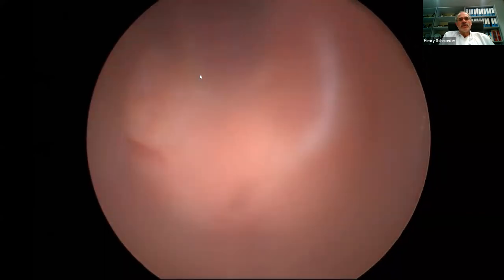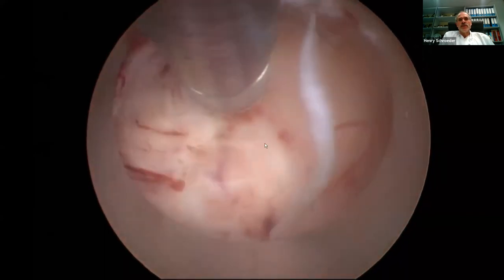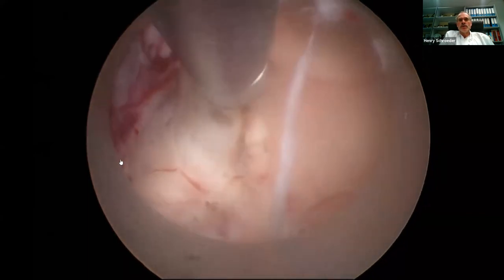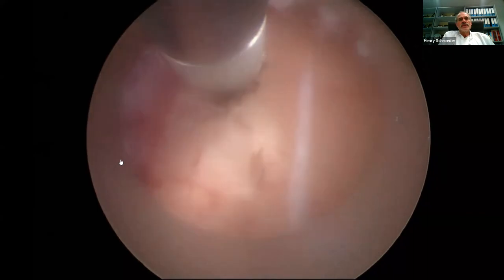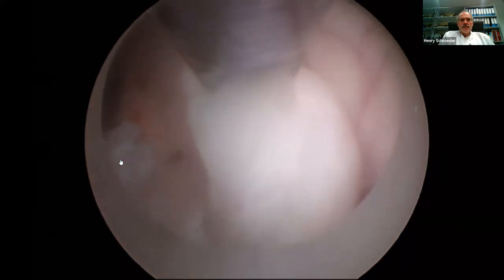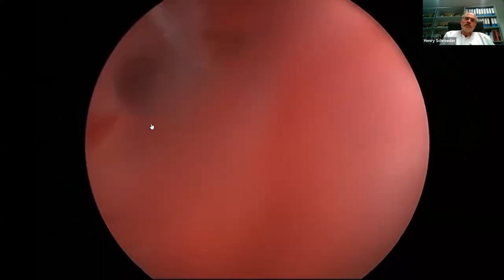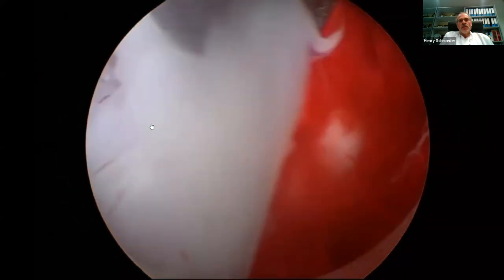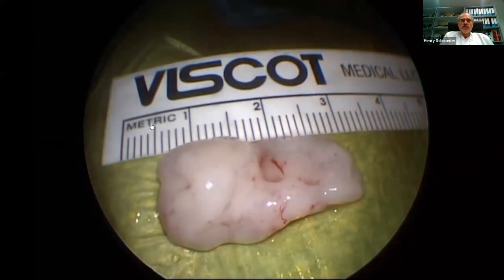You see, I go in with the tip of the endoscope. So it's a small chamber irrigation technique. I irrigate. I have a good view because the small room can be cleared. If the whole lateral ventricle is full of blood, you will not get a good view. So I detach the tumor completely, and then I try to remove the tumor through my endoscopic sheath, but it is too small. So I have to remove the whole system, endoscope with endoscopic sheath together, and I bring all the tumor out of the cortical puncture channel.